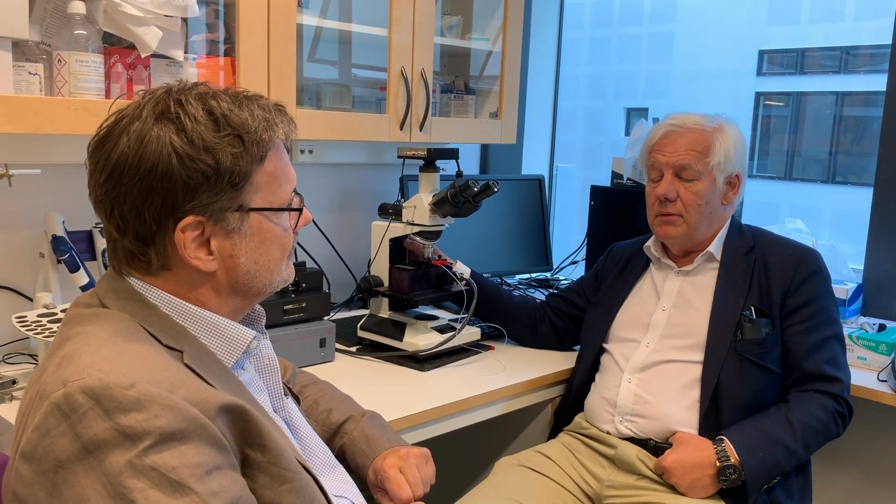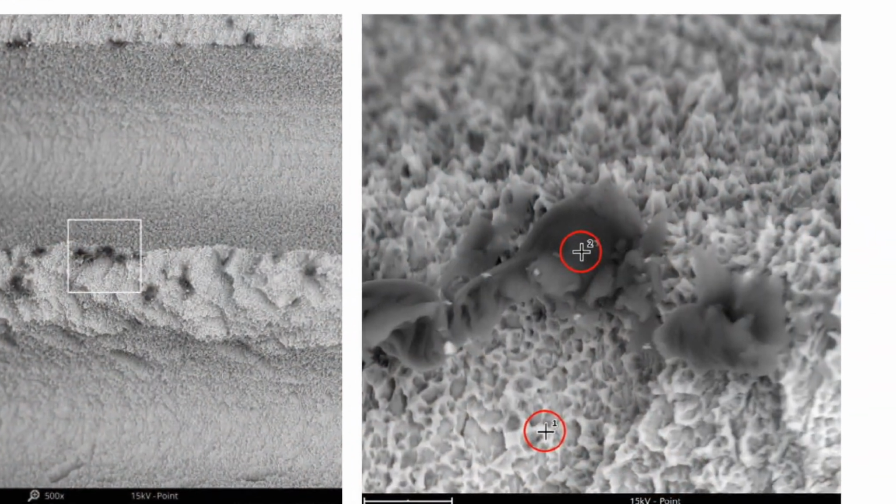I fear so. I've seen quite a few of the images you have produced from these implants. And in the beginning, I must admit, I was astonished that they could sell some of those implants to customers. And I fear that this may be one of the reasons that we have overlooked in the past, that implant impurities that haven't been cleaned away can pose a problem. We don't know precisely today. We don't have any precise levels of what human beings can tolerate or not, but I would certainly prefer things to be clean compared to having to find out where the borderlines of dangers are.